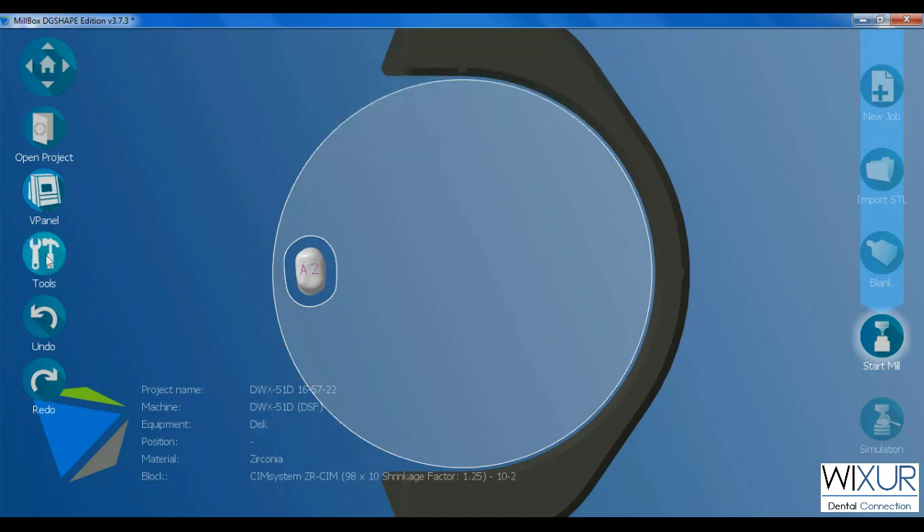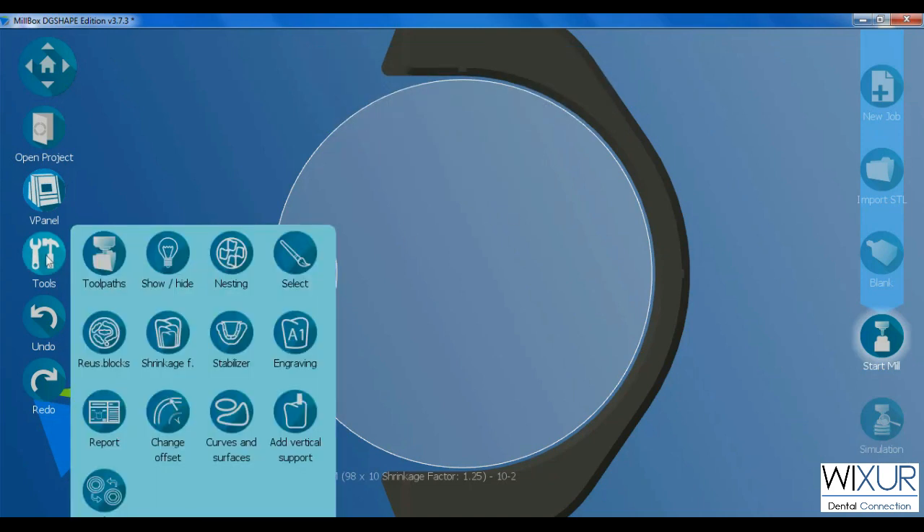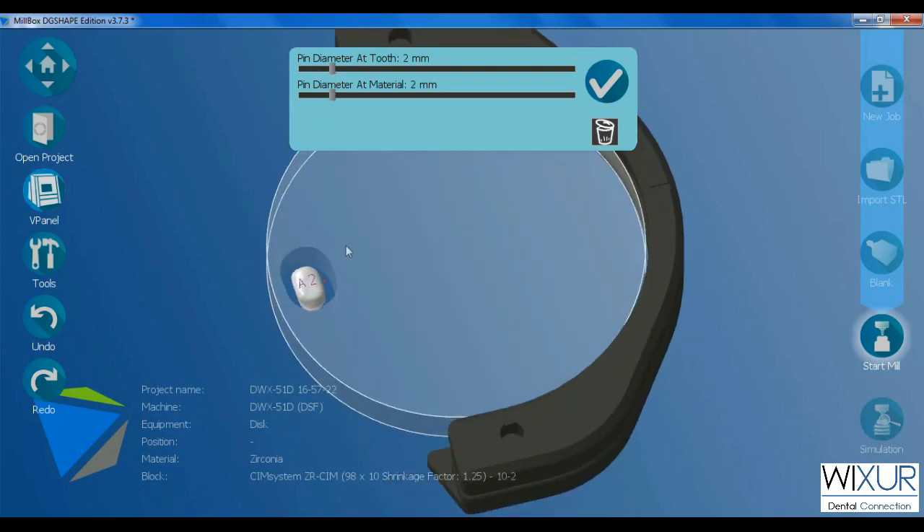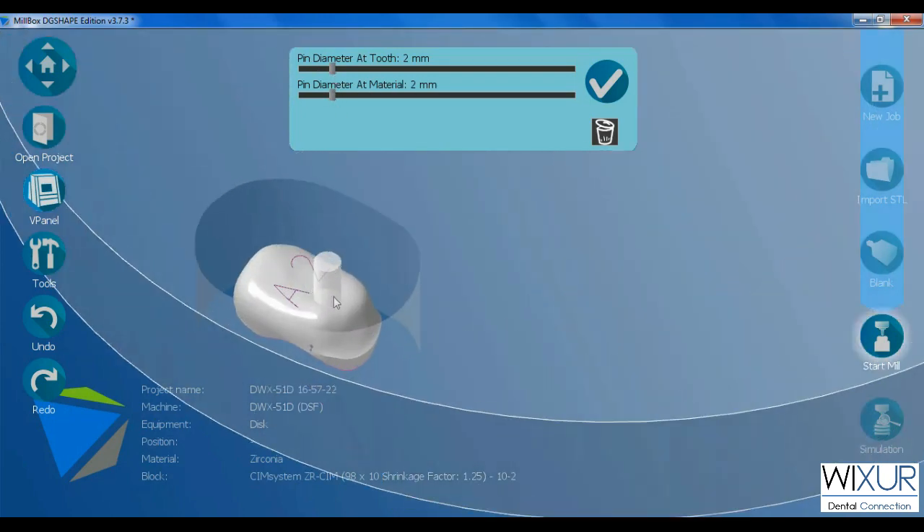The last option for today is Vertical Pin. I click on Add Vertical Support. Adjust the pin diameter at the tooth and at the material, and simply by mouse left-click, place it on the occlusal side of the crown.